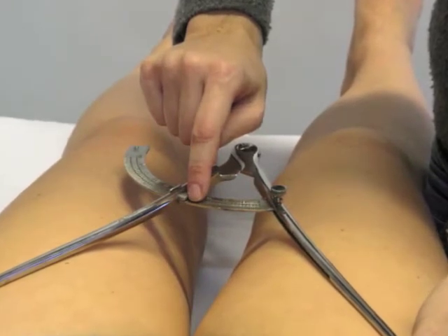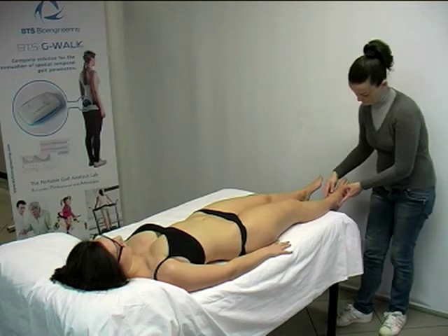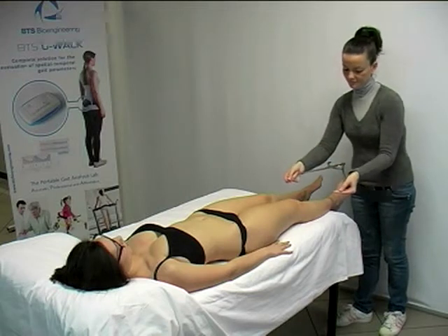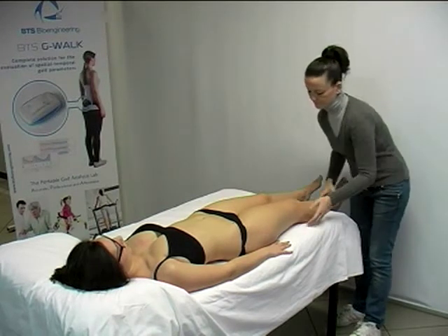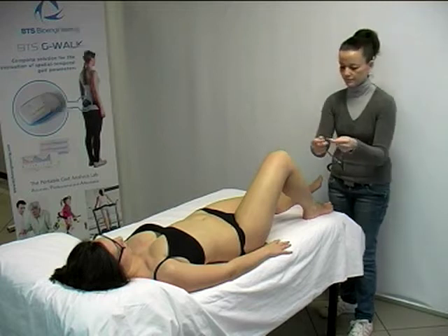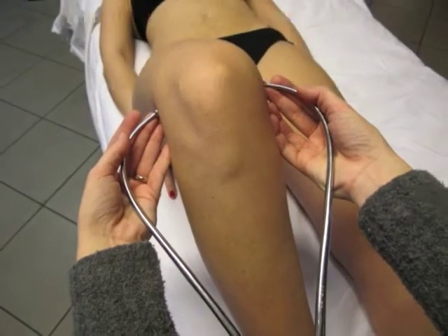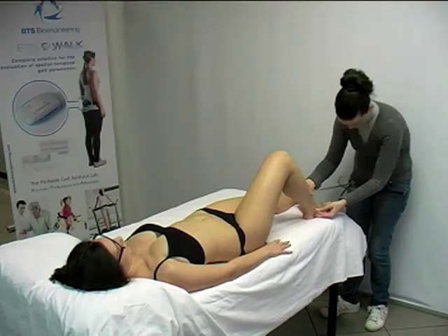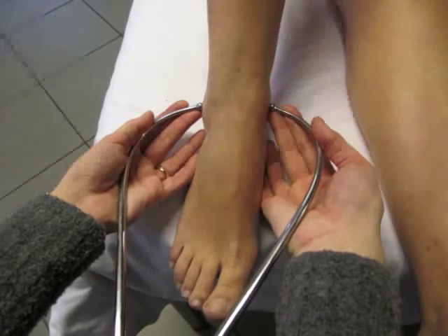Don't make confusion reading the scale below because it is expressed in inches. Now I show you how to measure the knee and the ankle diameter, because I still need the pelvimeter. I prefer to take all the measures for which I need the same tool. For the measure of the knee diameter, it's necessary to identify the lateral and medial epicondyle. If you move the knee in flexion, you should find the identification simpler. Keeping the pelvimeter in your hands in the same way, lean the two small knobs softly on the two points and read the measure. Repeat the same procedure for the ankle. The diameter is assessed between the two apexes of the lateral and medial malleolus.